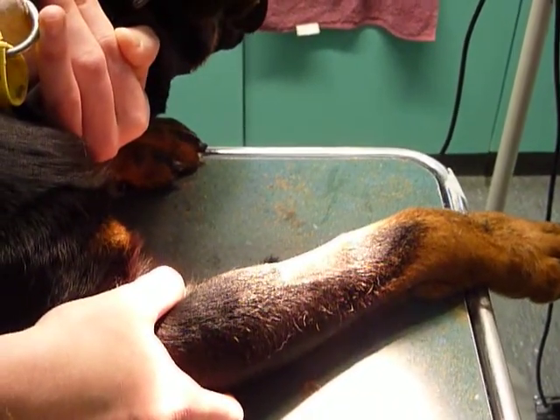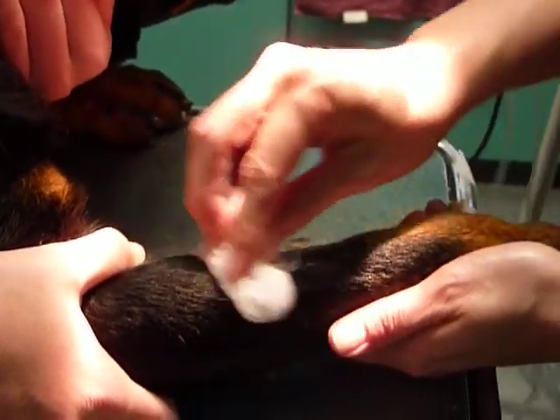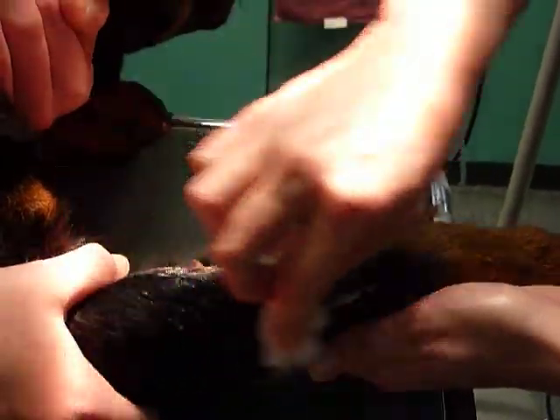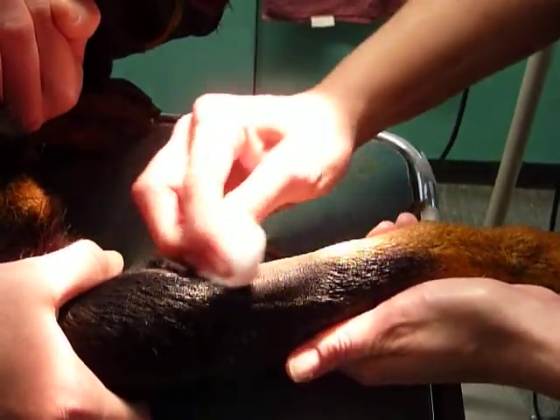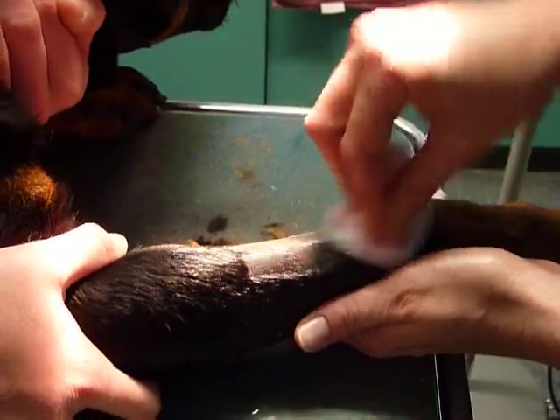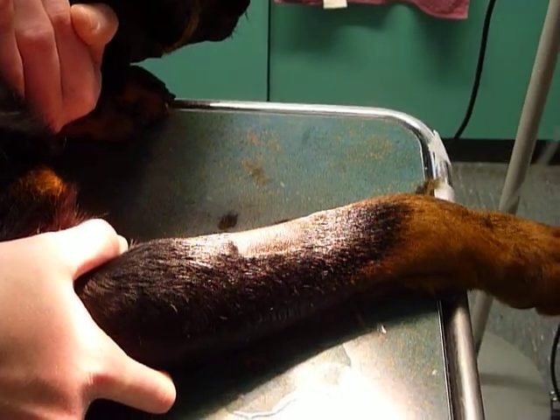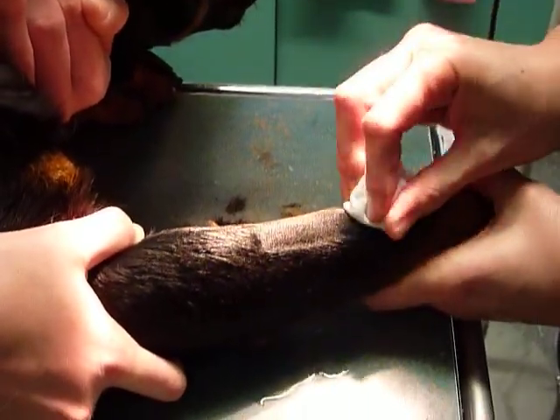Then we are going to clean the site using Microshield 4, which is a soap solution of chlorhexidine and aqueous. Give the site a good scrub and get some nice white foam. Then remove the foam using just aqueous on its own. The last step is using a tincture swab to remove any excess aqueous, then a multi swab to dry off the fur around the side to ensure you get a good stick with the tape.